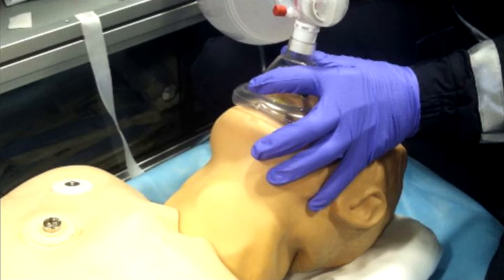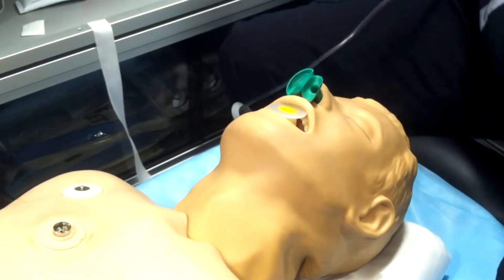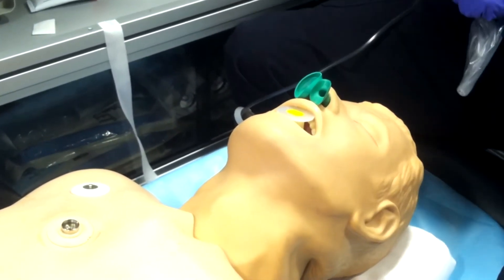Now we're going over the best way to protect an airway with an extraglottic device — more specifically, the LMA Supreme. We're bagging the patient using the best possible BVM technique with two NPAs and one OPA. The patient is at a saturation of 100%, and thinking back to our oxyhemoglobin desaturation curve, we have upwards of two minutes before this patient starts to desaturate — so use that time to get your airway ready.